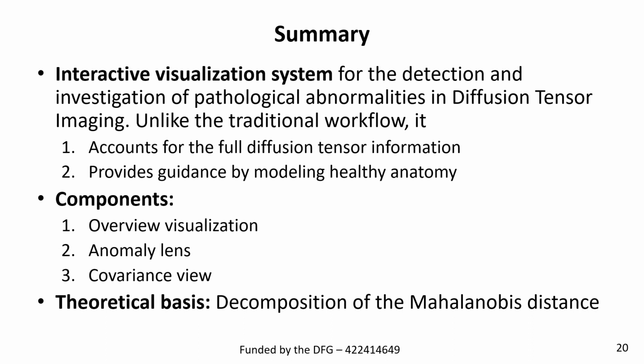In future work, we hope to extend this approach towards even more advanced variants of diffusion imaging.